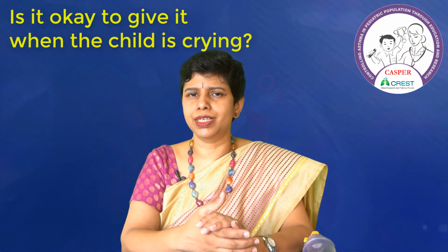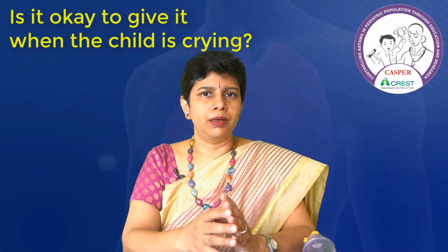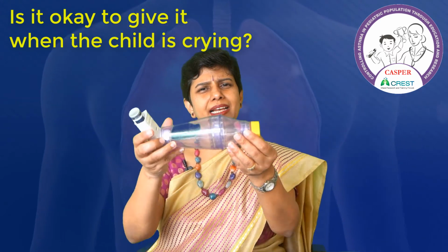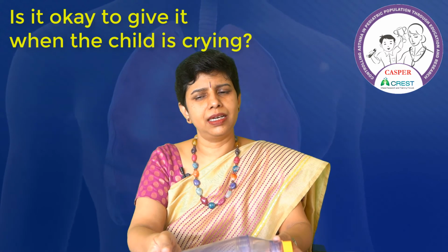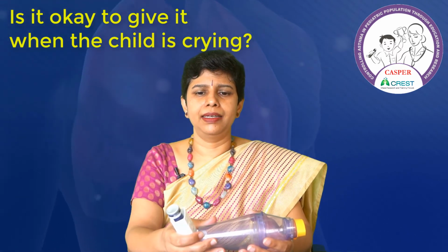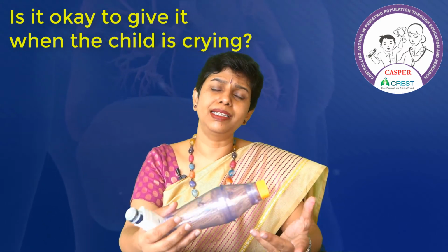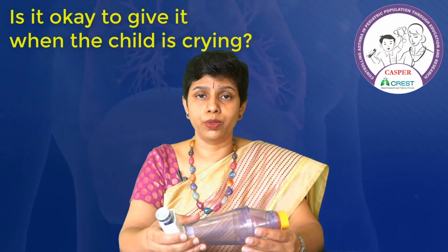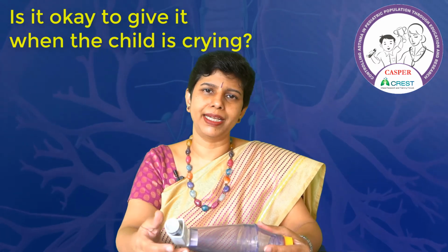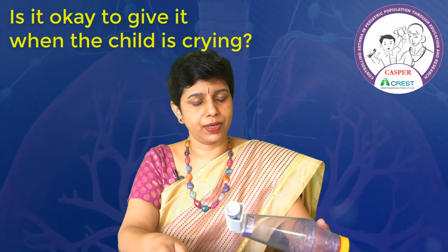Initially, of course, children will not accept it. They will try to reject it, they will cry, etc. But just give this inhaler to the child, ask the child to play with it, make friends with the inhaler device, and show them. Do it yourself, do it on another child who is a little older. Let the child realize that it's not going to hurt, and then maybe you can give it. Initially the child may cry, but later on the child will get used to it. Preferably don't give it when the child is crying.